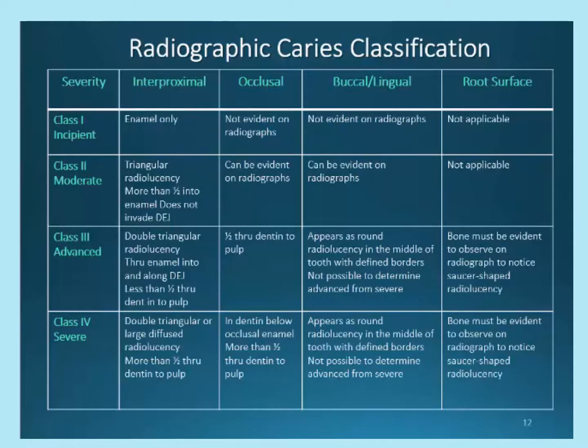Going back to radiographic interpretation of decay and moving away from Black's, I will leave you to review this chart on your own. I created this to help you review the radiographic classifications and the possible areas that they may appear when exposed to X-rays. The following slides will go into more detail.